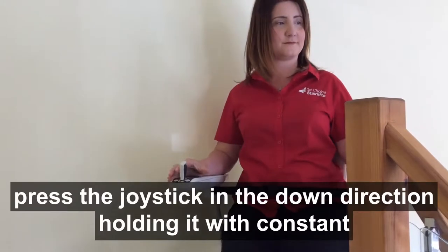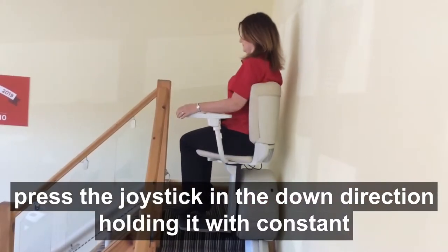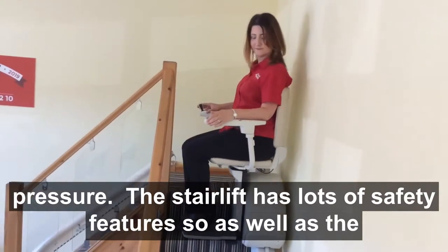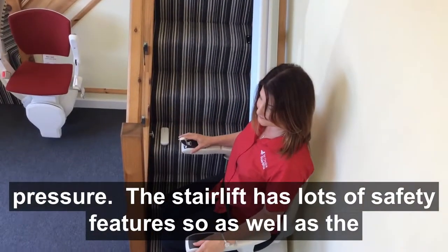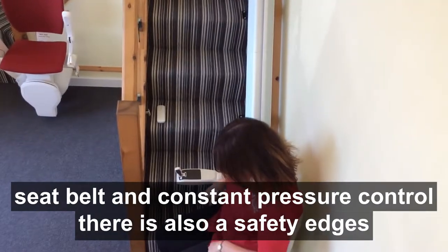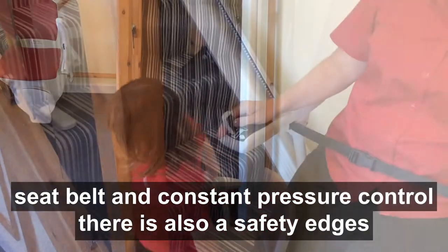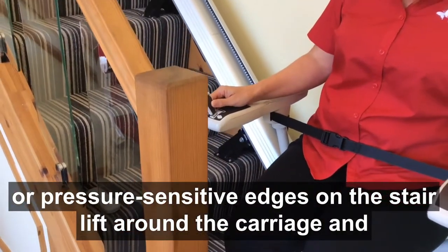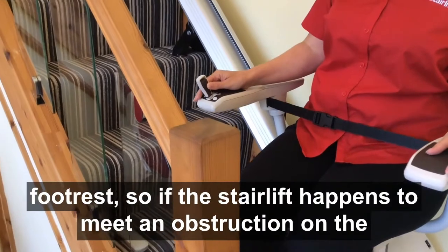To come downstairs, press the joystick in the down direction, holding it with constant pressure. The stairlift has lots of safety features — as well as the seat belt and constant pressure controls, there are also safety edges or pressure-sensitive edges around the carriage and footrest.